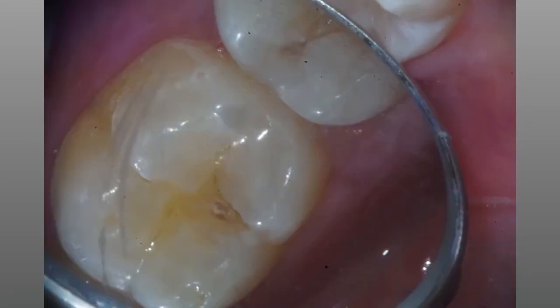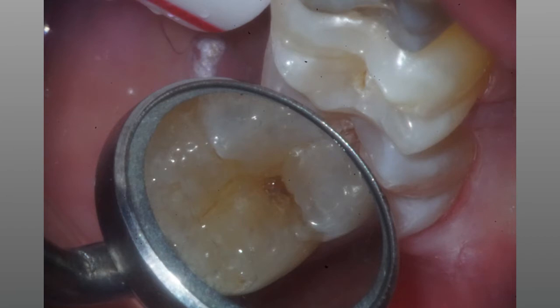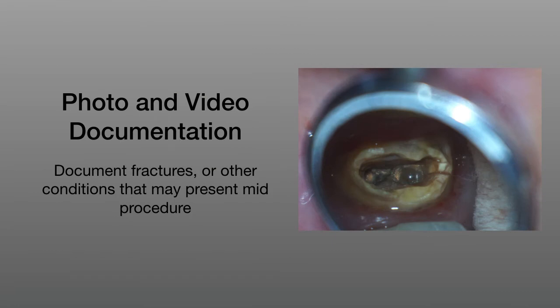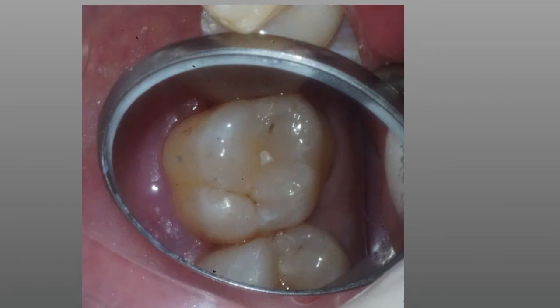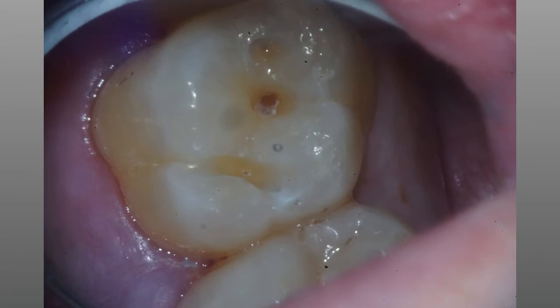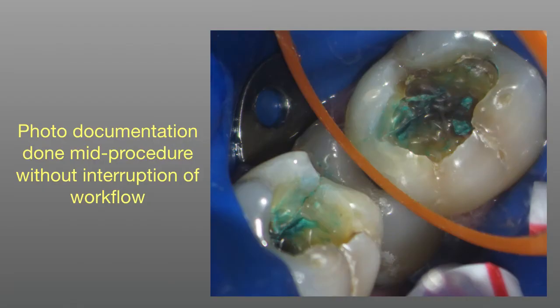From the beginning of the procedure to mid-procedure, you can take photos to communicate with the patient, to document things for insurance, or for educational purposes. We can document fractures or other conditions that may present mid-procedure. We see some occlusal decay and a suspicious sealant. We can document the procedure as we go — remove the sealant, see demineralized enamel, clean the enamel, and see that the decay has perforated the enamel and infected the dentin. This photo documentation done mid-procedure, without interruption of the workflow, is a key benefit.